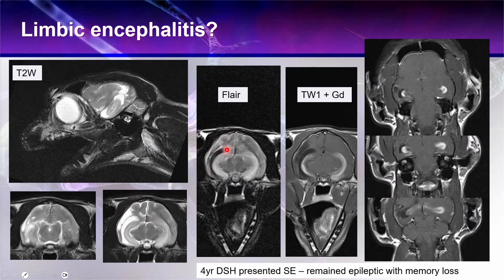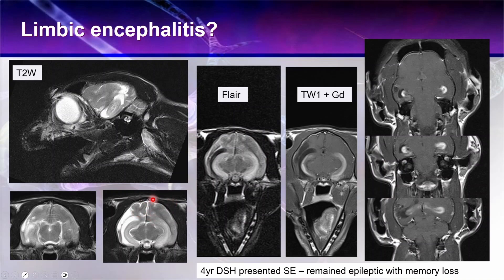When we look at the FLAIR, this can help us. The black area here is the tissue and the white area is the ventricle. We can notice it looks very different to the other side — there's already significant atrophy going on in this cat. By contrast, this other area is showing a lot of white signal, and we can see some brain tissue in there, but it's so black in some areas that this must be necrotic. There's a lot of signal on the outside, suggesting a meningeal component. The subarachnoid spaces are really well pronounced in comparison to the other side, indicating cortical atrophy.